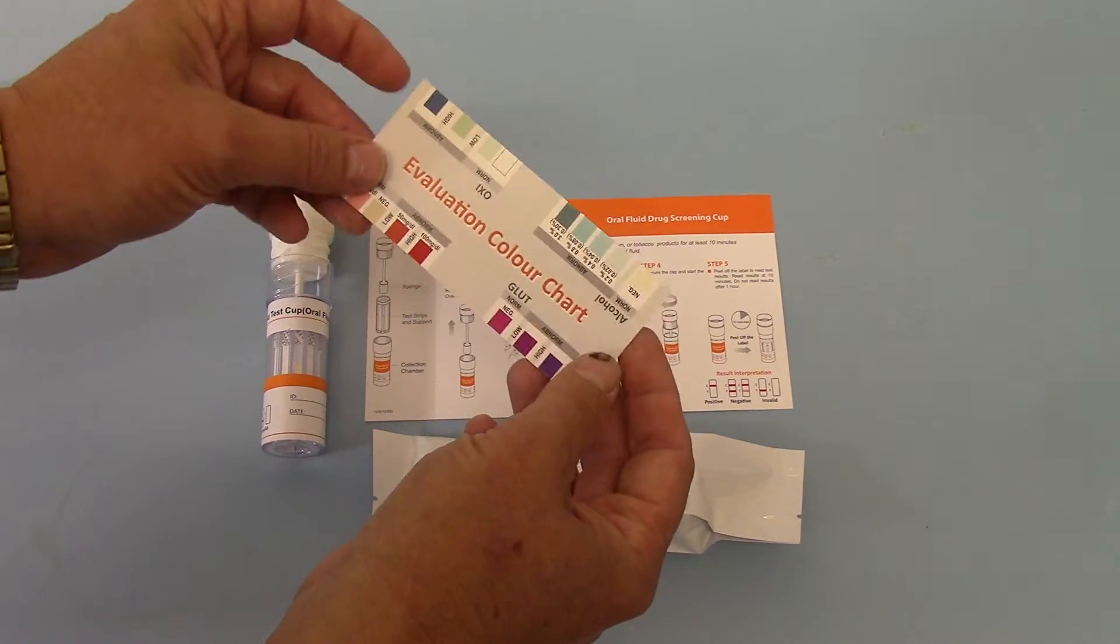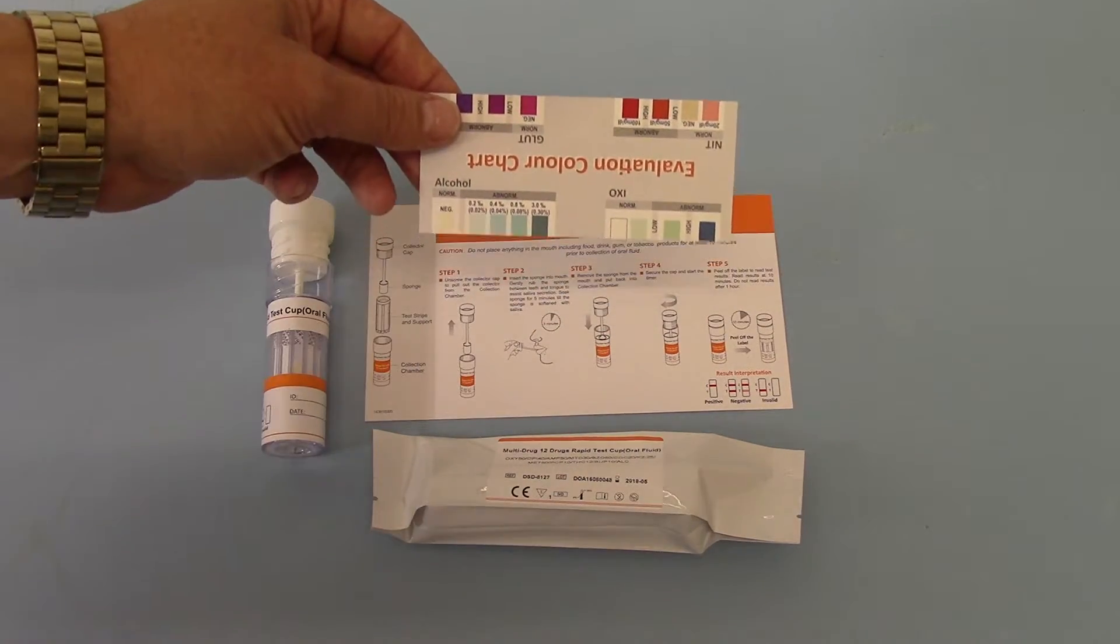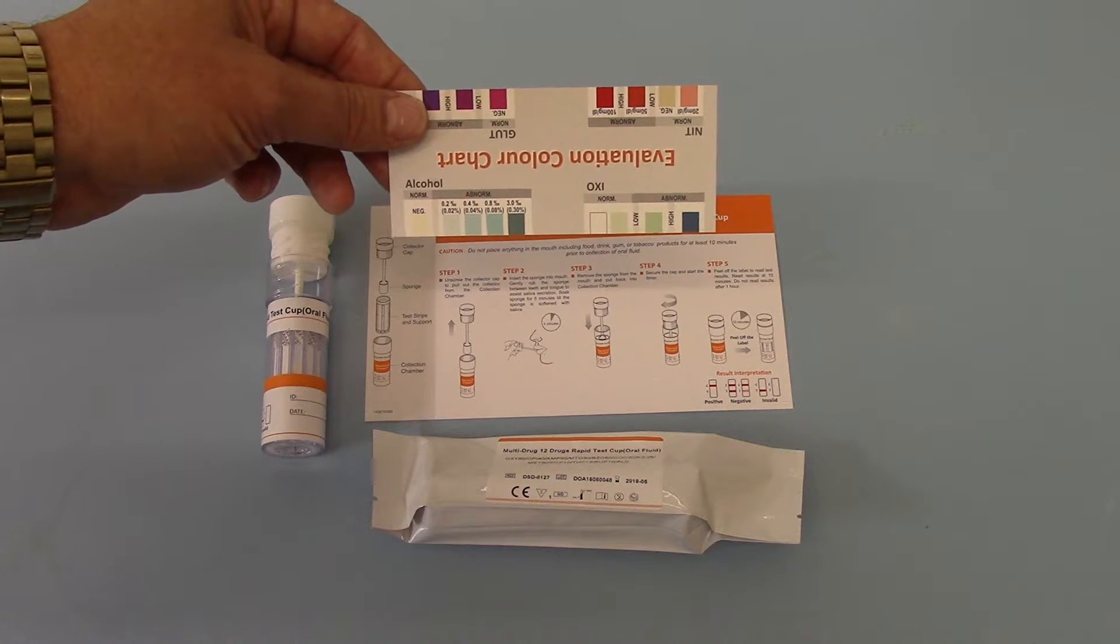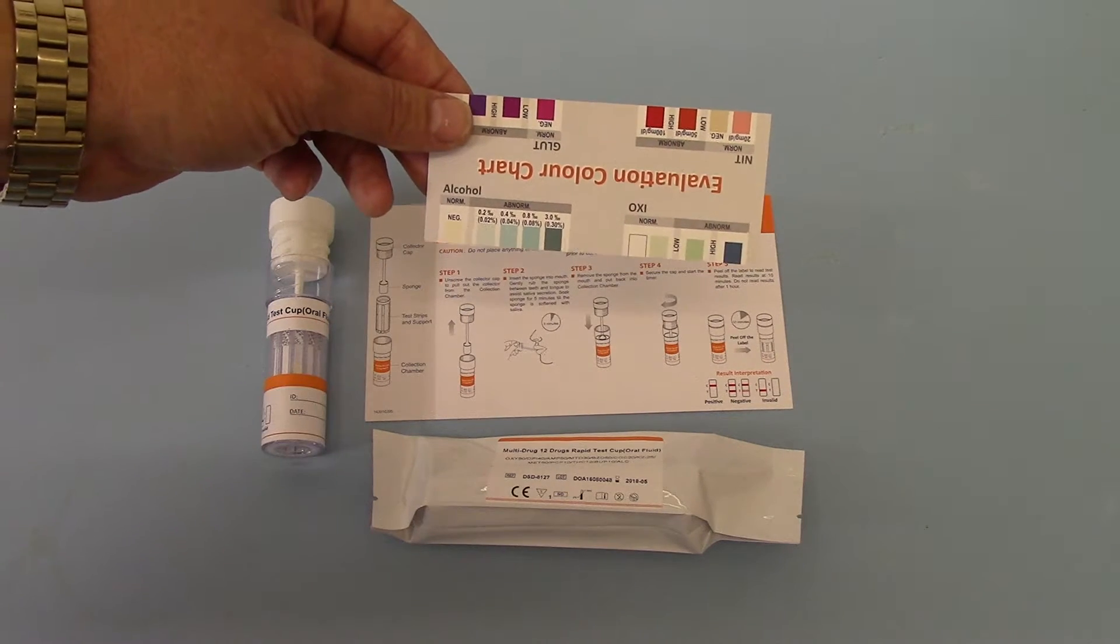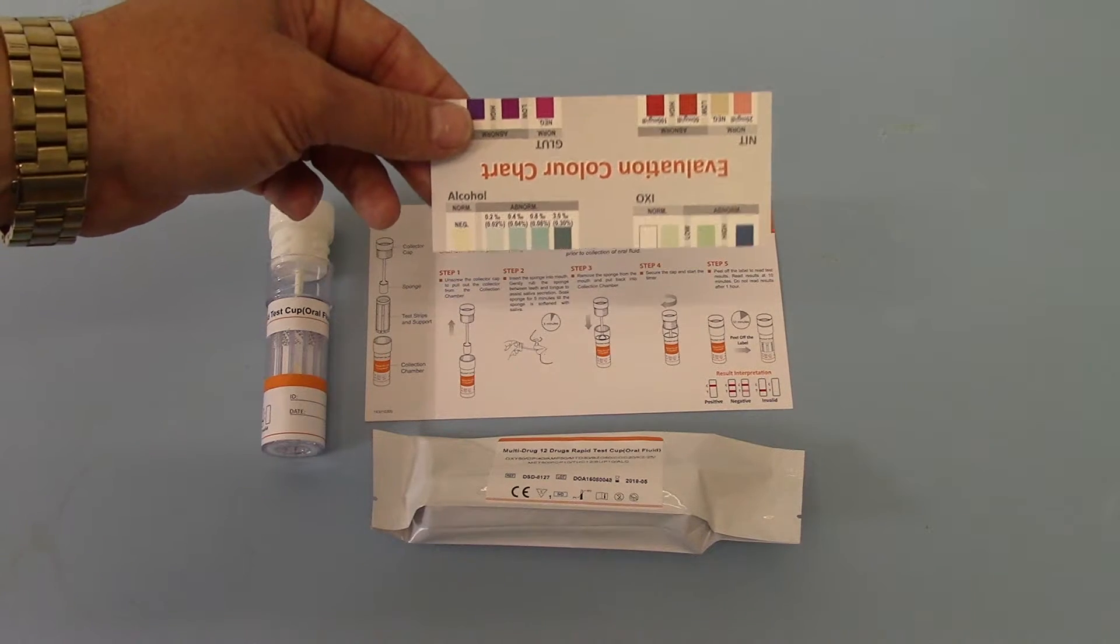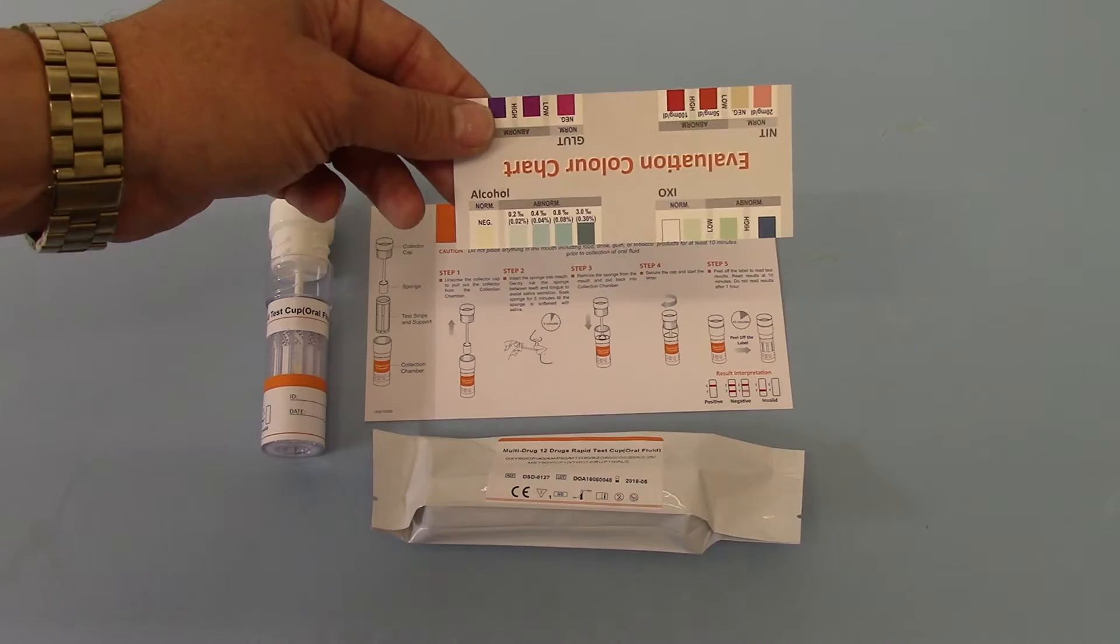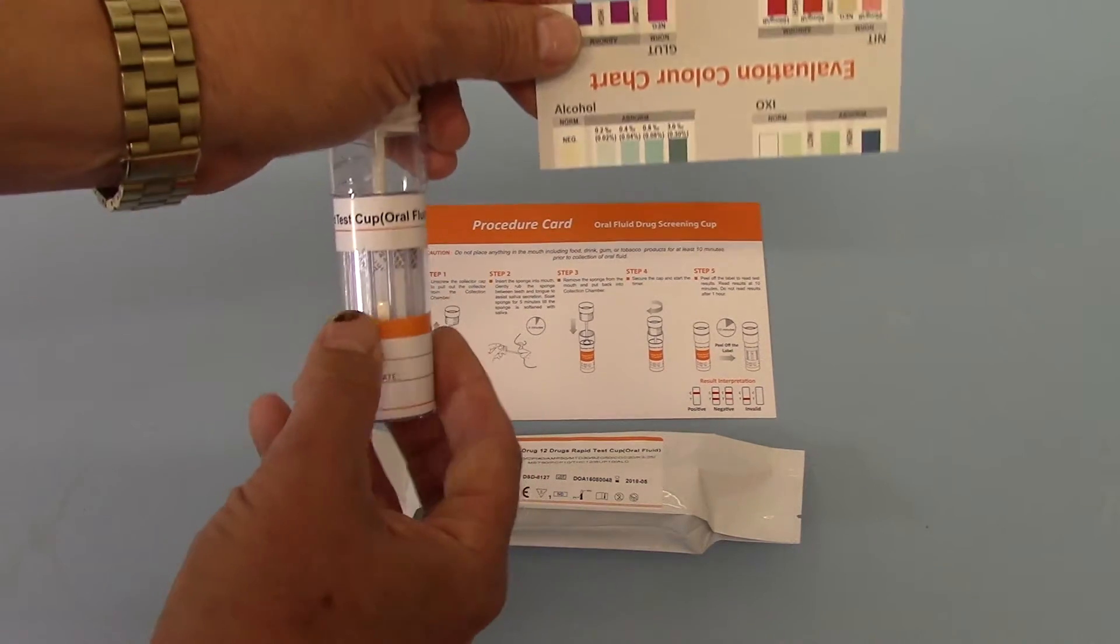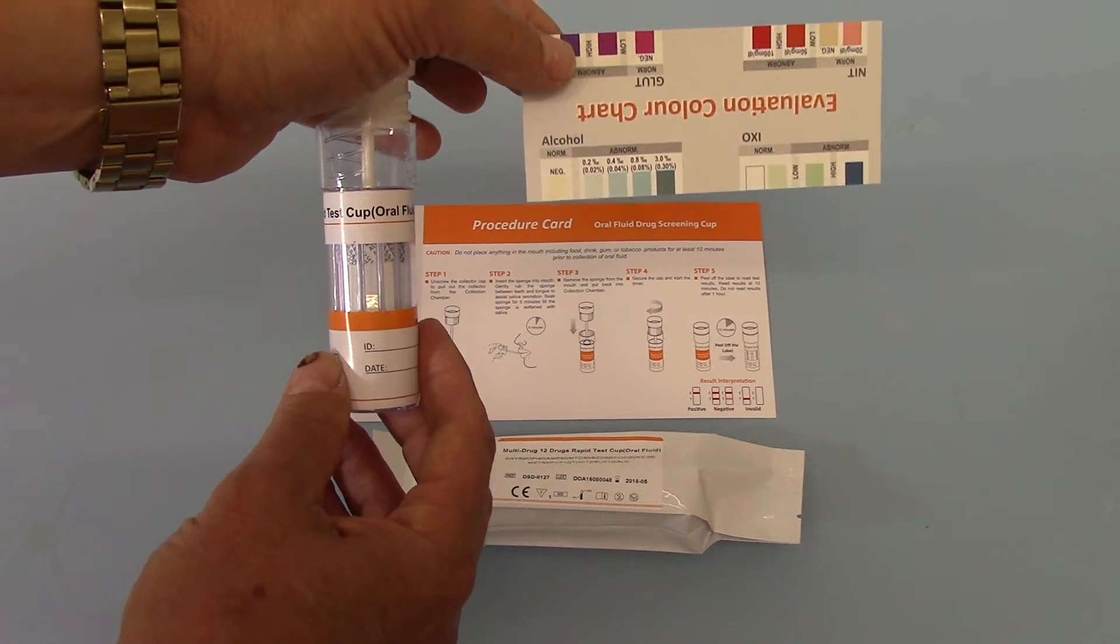So, the first thing to say about that in relation to this test is to ignore all those. The only relevant element of this evaluation card which you need to pay attention to when reading your results is the alcohol evaluation. This will show that the negative result is a simple non-colour-changing pad which will remain in the slightly cream-off white color that is shown if we show you the test before it's run. That is the negative result and it's the non-run color pad.